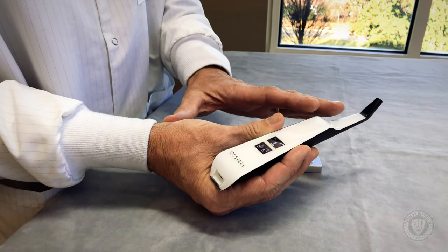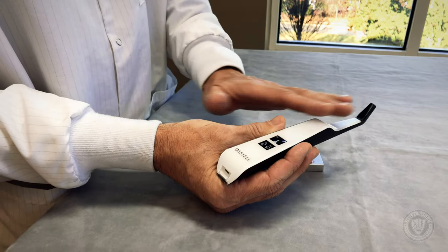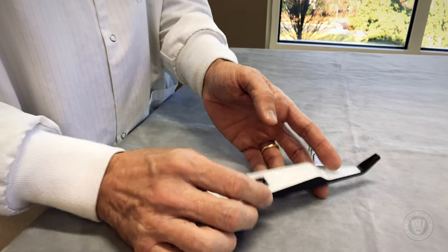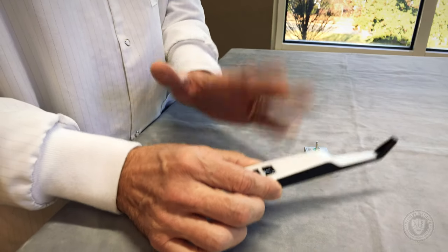The first thing you'll notice is wireless, which is always a benefit in the dental office. The second thing is there's no buttons on it, and that's because it has a motion sensor so that it turns itself on and off when you pick it up and set it down, which is really cool.